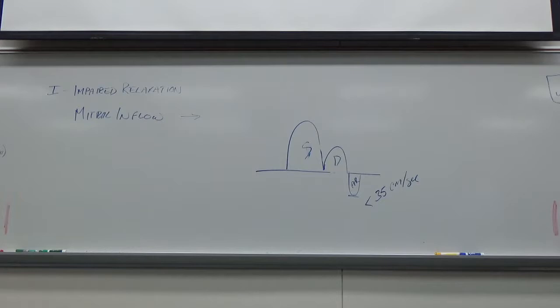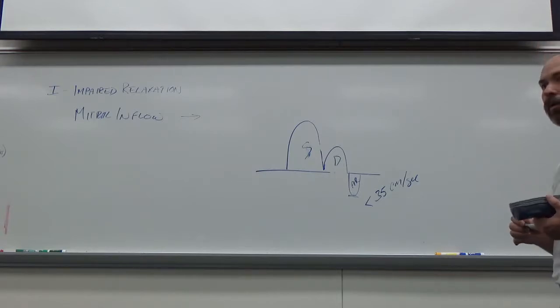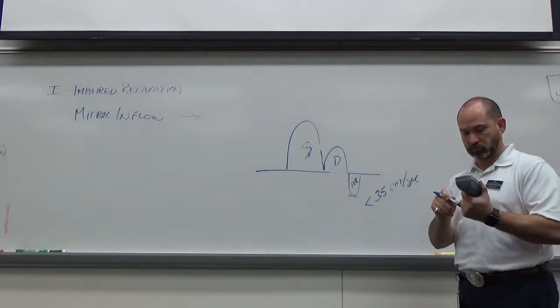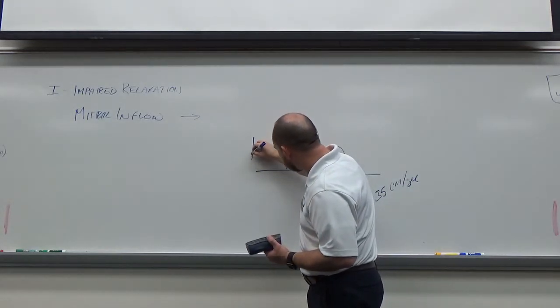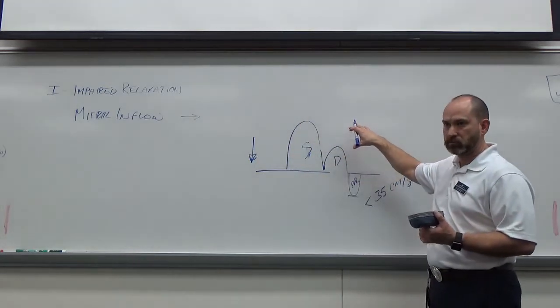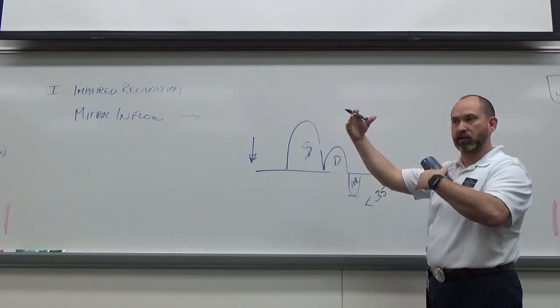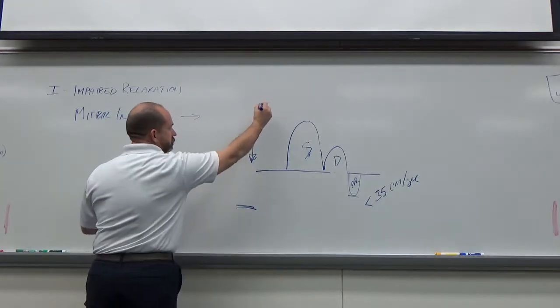Okay, so any questions on this? So this is pulmonary vein, so what's next? Baseline and scale. Where do we want the baseline and roughly what scale? Not in the middle, because which waves are biggest? Whatever I'm interested in should take up about 50 to 75% of the height of my screen, okay? So if the bottom of my screen should be like here, this one needs to be up here.